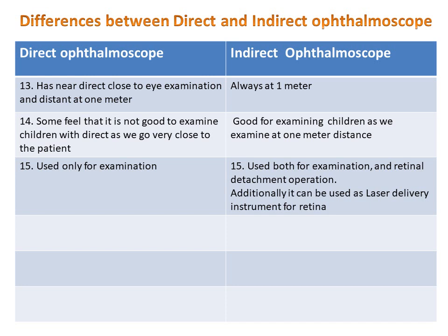And you have laser delivery system. For example, if there is a case of diabetic retinopathy, if you want to deliver green laser and do green laser photocoagulation in that particular patient, you can use that as a delivery instrument, laser delivery instrument. So additionally, it can be used as laser delivery instrument for retinal diseases.